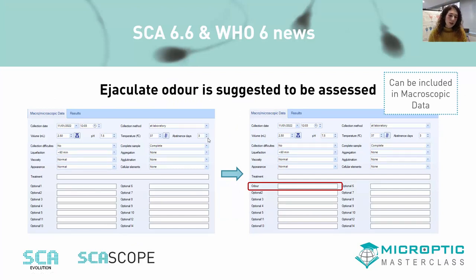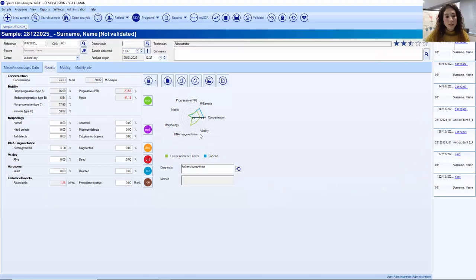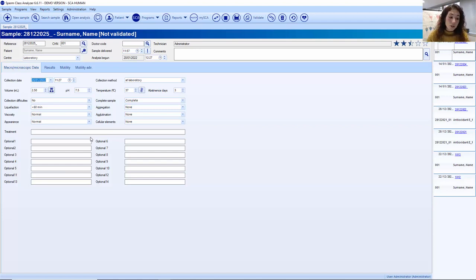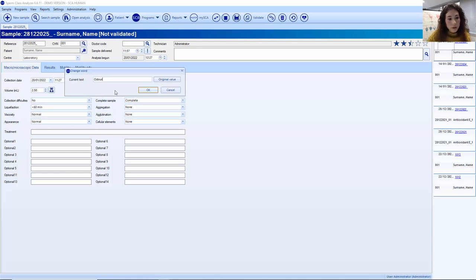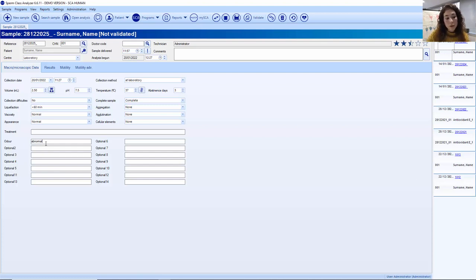Also, the ejaculate odor is now suggested to be assessed. This can be a problem, as it is subjective and in this COVID era we don't know if it is safe for the technician. However, it is a parameter that has been proposed. In our system, you can use the macroscopic data section, which includes 14 optional fields. By double-clicking, you can change the title and set it as normal or abnormal. Once you change one of these optional fields in one sample, it will be applied to all samples created from that point on, standardizing the information across samples.